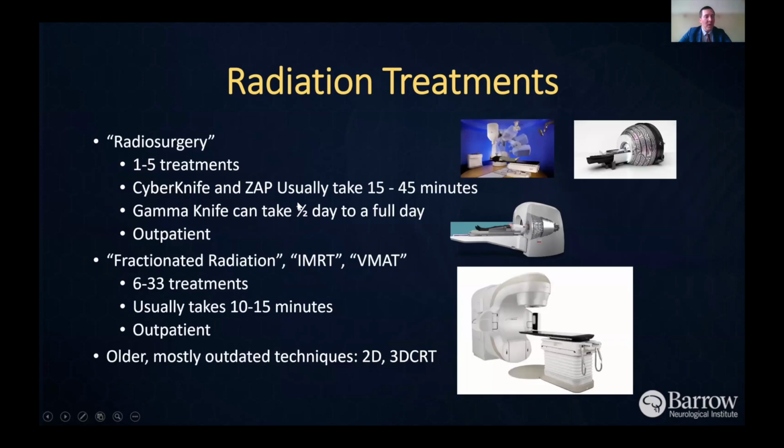Sometimes you'll hear about something called stereotactic radiosurgery, or SRS. That's basically when we give a higher dose of radiation per day over a relatively short period of time, in 1 to 5 days, although the individual day or days are typically longer. Sometimes they're 45 minutes, sometimes they're a couple hours. Although the machines that deliver SRS often have knife in the name, including CyberKnife and Gamma Knife, and it's called radiosurgery, there are no incisions, and this is done all in the clinic, not in the operating room.